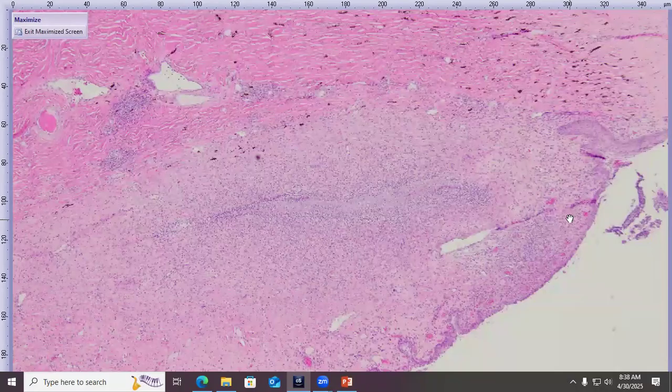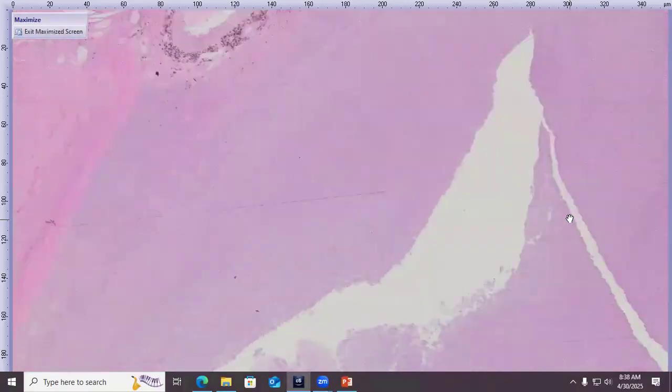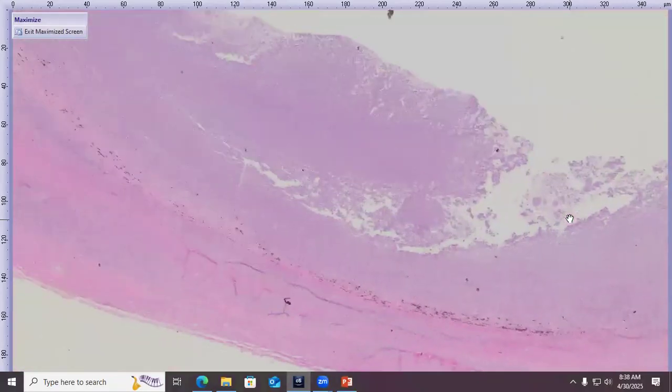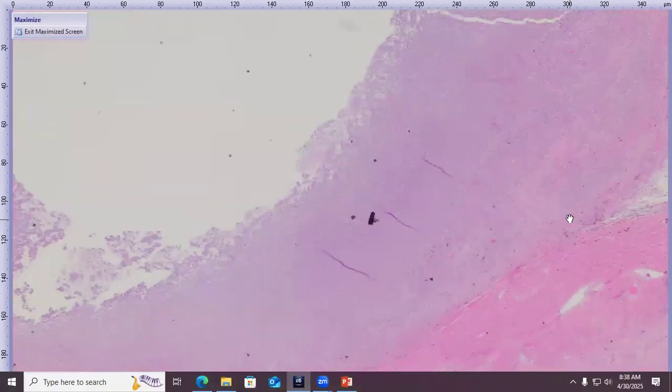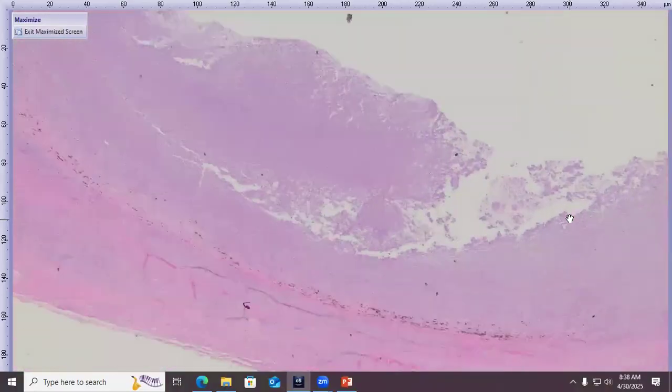It's a beautiful suprachoroidal location, right? Nicely encapsulated. It's just sitting right there. Well, it does spill a little bit around. But point out how nicely it is under the choroid and between the sclera. It's the exact place for placement of those suprachoroidal injections that people are trying to get. It was a suprachoroidal injection of bacteria by like a thorn or something, maybe.